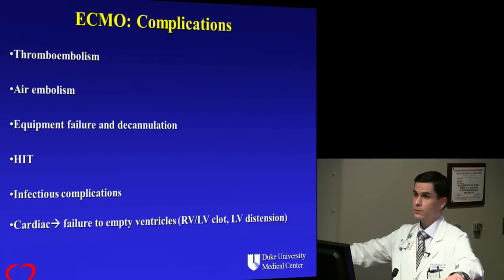Additionally, when you have additional ports to the ECMO circuit, such as for CVHD or plasmapheresis, it is another area for introduction of air. Heparin-induced thrombocytopenia is a significant problem in cardiology and cardiac surgery. And ECMO, obviously, we maintain these patients generally on heparin. We will maintain patients on bivalirudin, but we've had a number of patients with HIT.